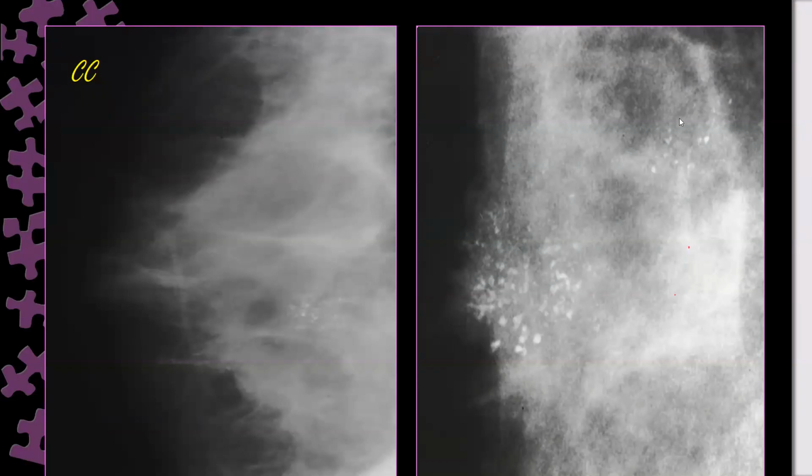So this is most likely multifocal, or it might be multicentric if we look for the rest of the breast, but at least it is multifocal DCIS, with or without invasive component, it depends.